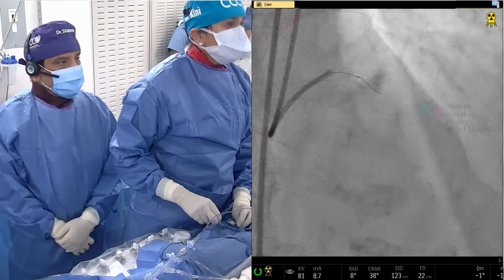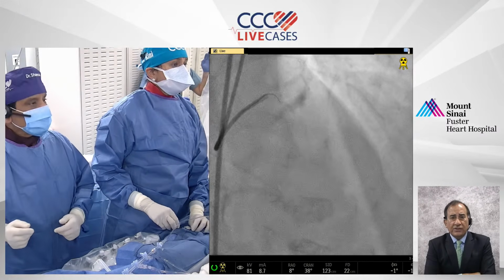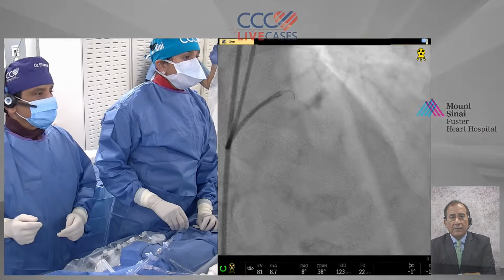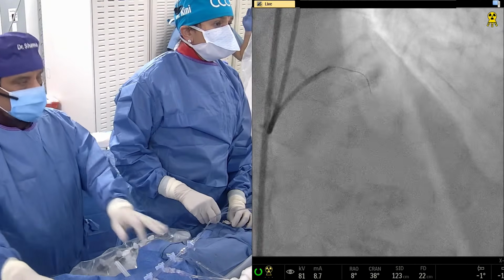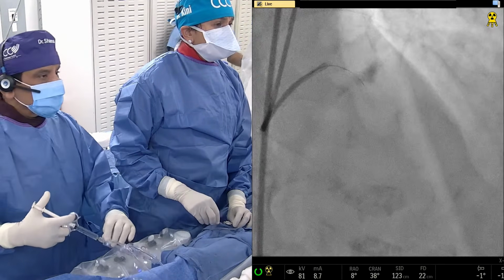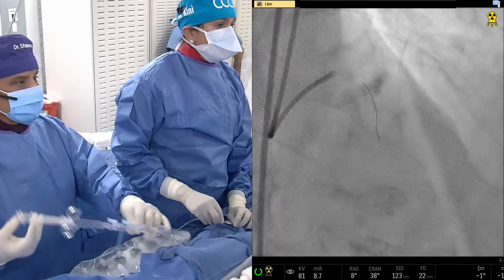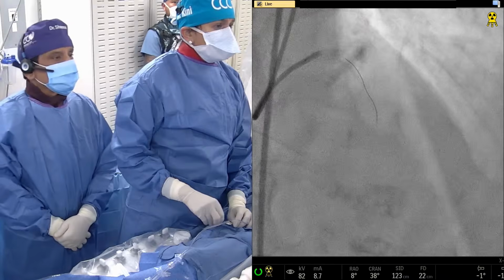Just before you started, you made a statement that the lesion looks worse. No, the thing is, that's not exact. I went and checked the old views, and they didn't have that kind of a cranial angle. That may be the reason we did not see it. But anyway, imaging will tell us right now.